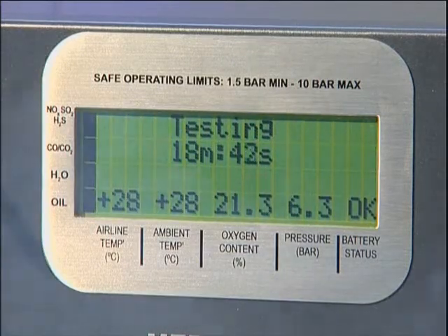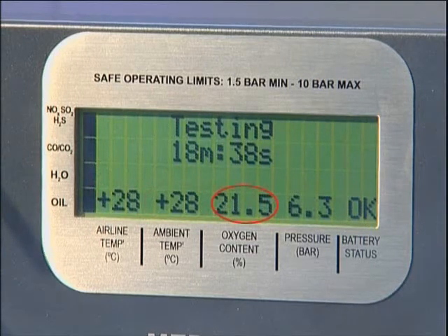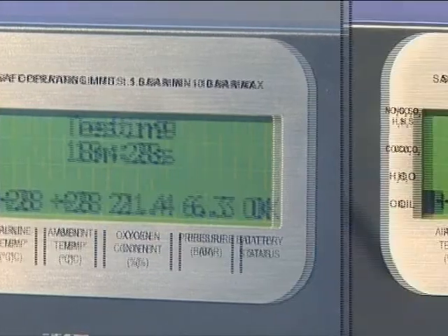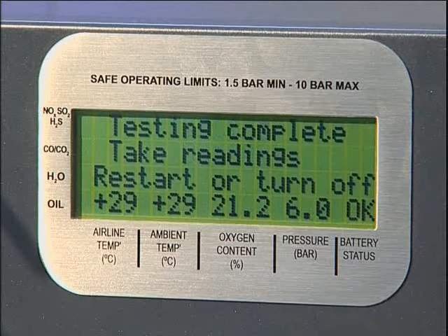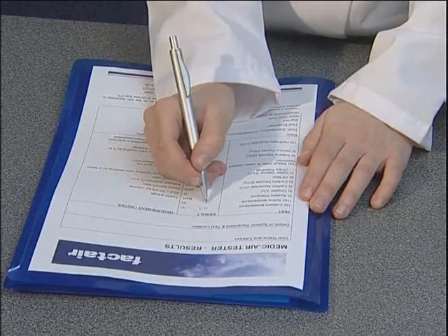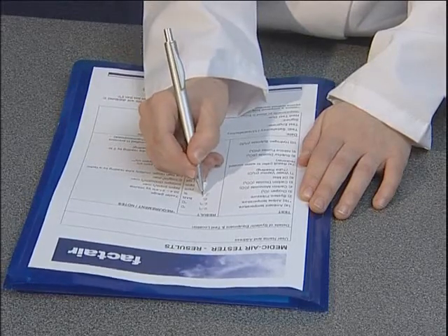The duration will be displayed as a countdown together with airline temperature, ambient temperature, oxygen content and pressure. The status of the individual tests is indicated on the left-hand side of the display. Black indicates test active and clear indicates test completed. The unit can be left until the test time has elapsed. The readings on the display will now be locked and the results should be recorded. Tube readings can be taken either at the end of the test or individually when the status bar indicates that flow has ceased through a particular port. Instructions on reading detector tubes and their safe disposal can be found in the documentation wallet.